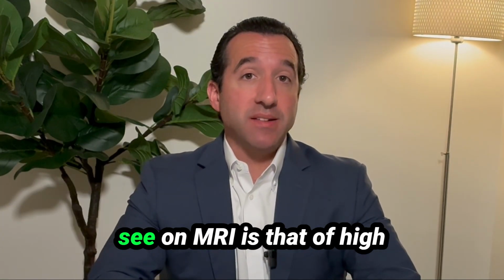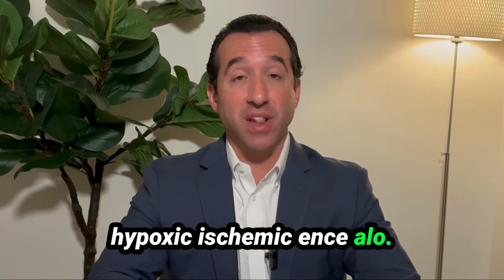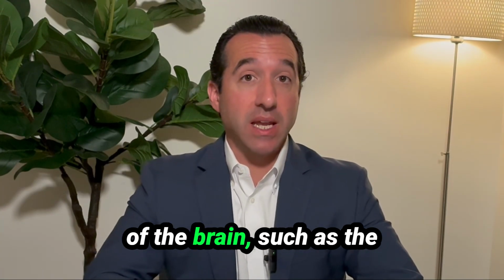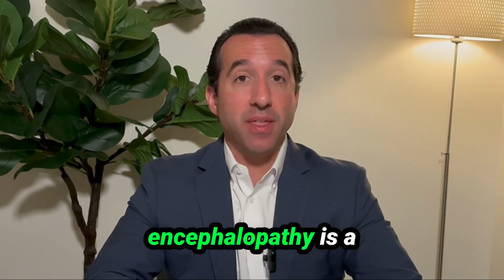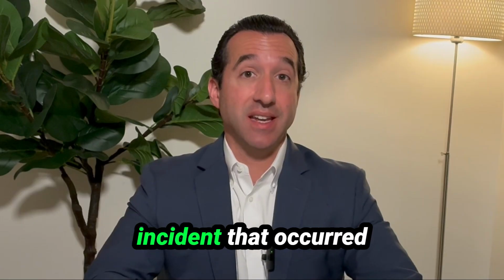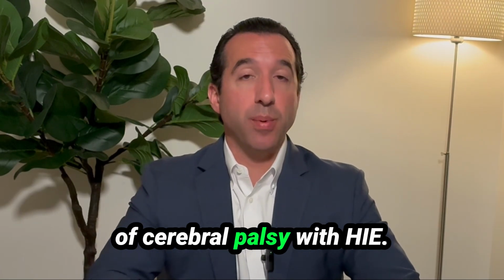Another finding you might see on MRI is that of Hypoxic-Ischemic Encephalopathy. That's a brain injury that affects different parts of the brain, such as the thalamus. Hypoxic-Ischemic Encephalopathy is a global oxygen deprivation incident that occurred during labor and delivery. You'll see different types of cerebral palsy with HIE.